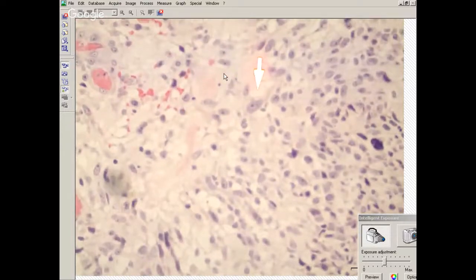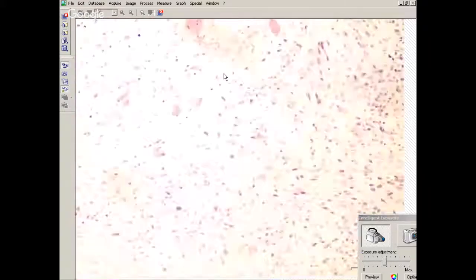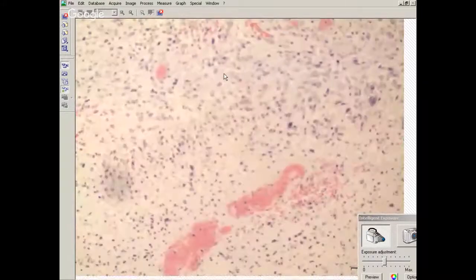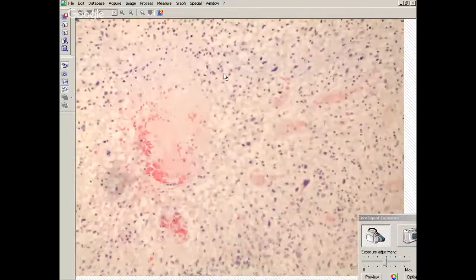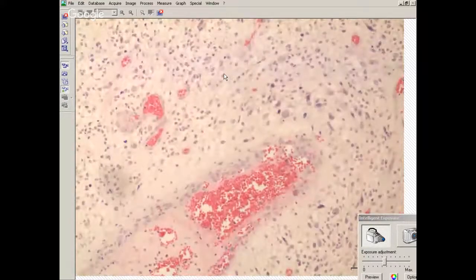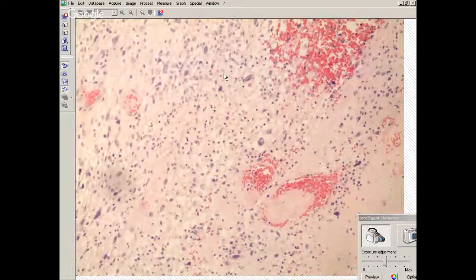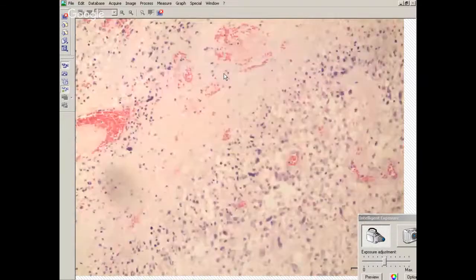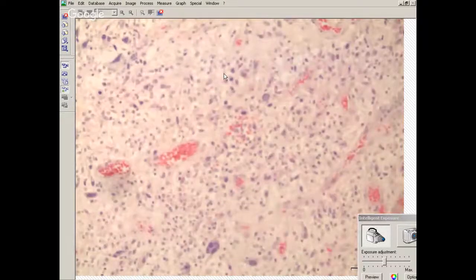This nucleus has indentations of the nuclear membrane. That's typical of astrocytic neoplasms. And with vascular proliferation and high-grade nuclear changes that are also astrocytic, with these elongate, irregular, hyperchromatic nuclei, that goes along with a GBM. So a GBM is going to end up having vascular hyperplasia or atypical vascular changes, as well as astrocytic features. Typically, there's a high proliferation index, although that proliferation index typically doesn't go above about 70%.